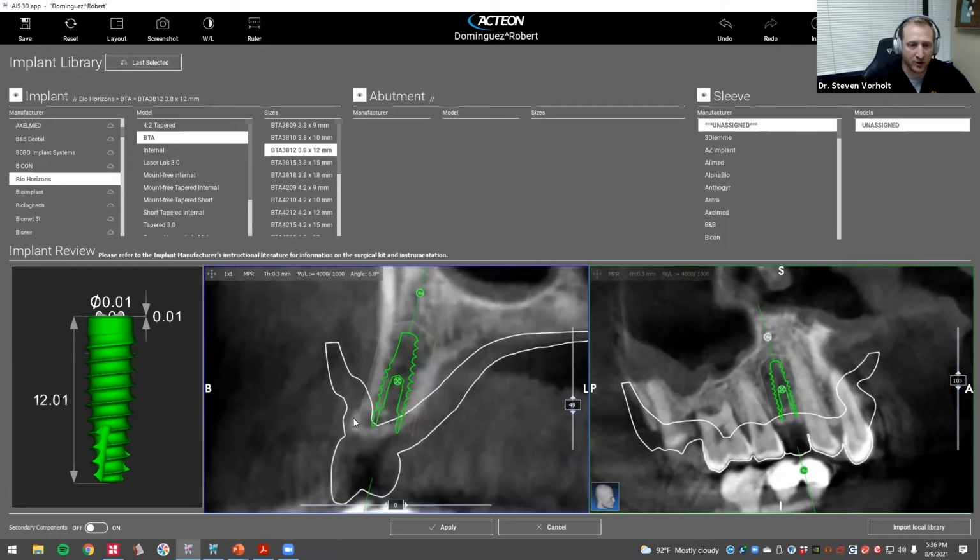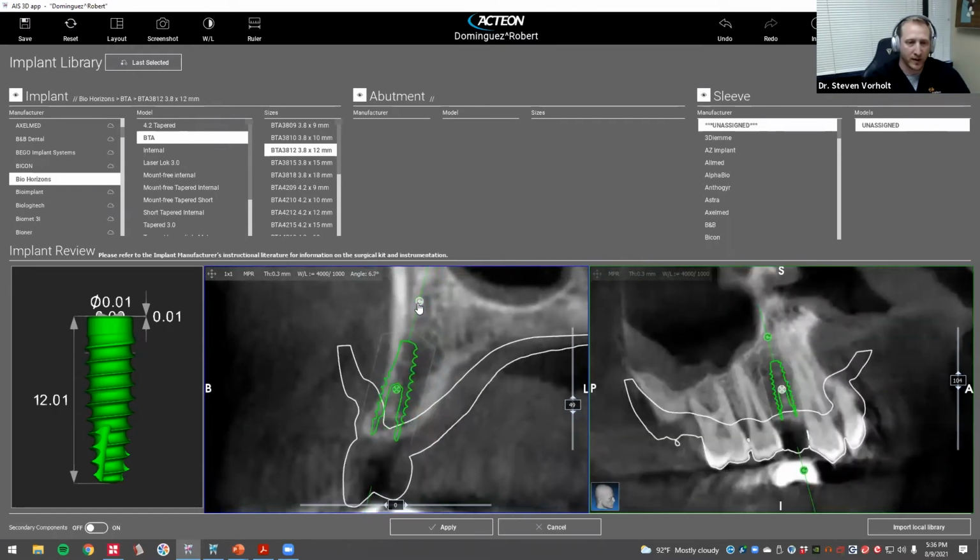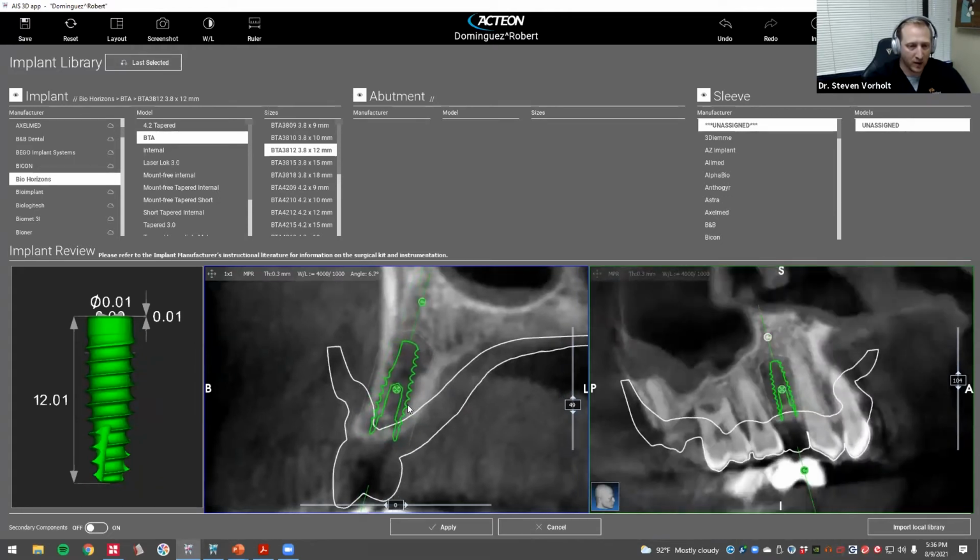I have to avoid this undercut. This is the kind of undercut that you can get in trouble with when you're doing implant surgery with a pano and a PA, and you flap and you see a nice big wide ridge, and you end up putting it right in the middle, and boom, you've perforated the buccal plate, or you're extremely thin and we get undiagnosed perforation or fenestration and bone loss. So we're going to be smart about this.